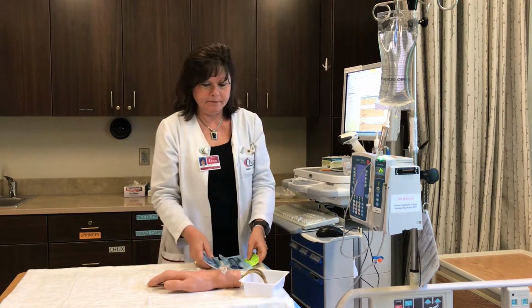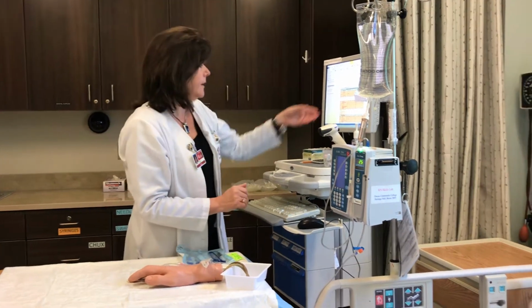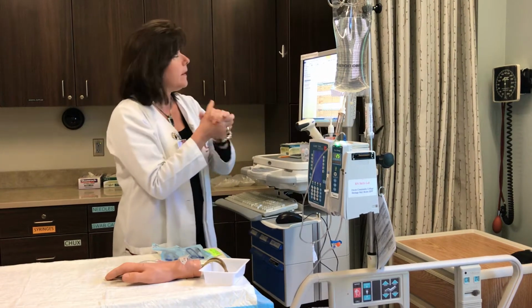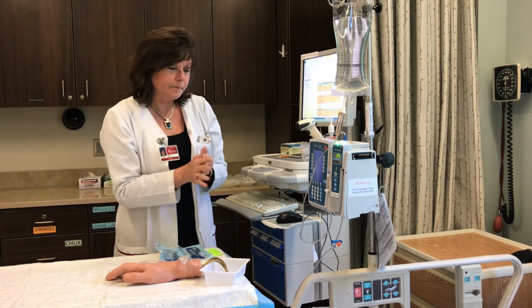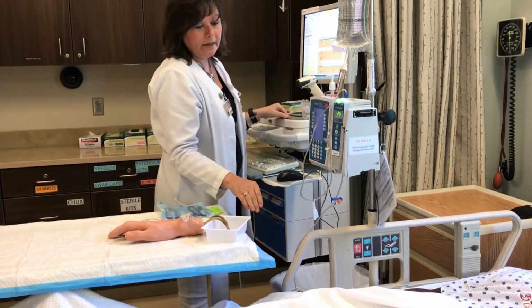Introduce self, name and credentials. Hi, I'm Mary Jo, the RN that's going to be taking care of you. Perform hand hygiene and provide privacy. I would pull the curtain. Identify client times 2 identifiers and compare to MAR. Scan patient armband. Verify allergies with patient.